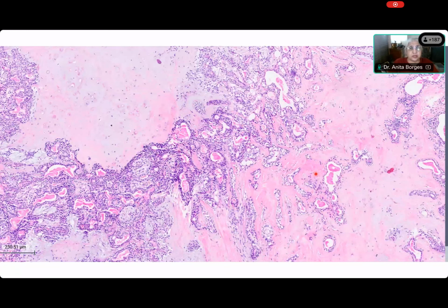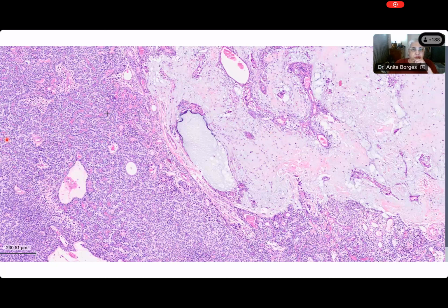I can annotate, but I don't want to because she said lymphocytes, and I want to see what she means by lymphocytes. What do you think are lymphocytes? What? You think all these things are lymphocytes? No, ma'am, these are tumor cells. Then why did you say lymphocytes? Sorry, ma'am. First things that come out of their mouths. So what are you seeing?